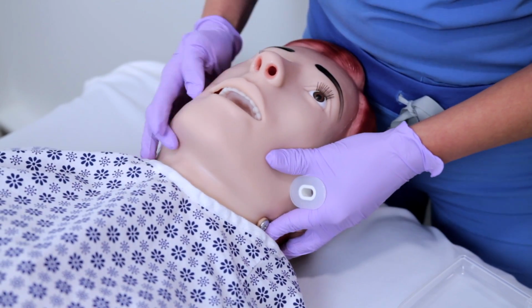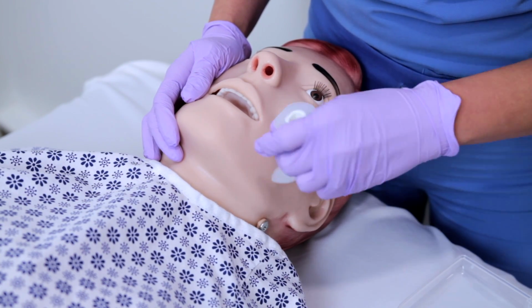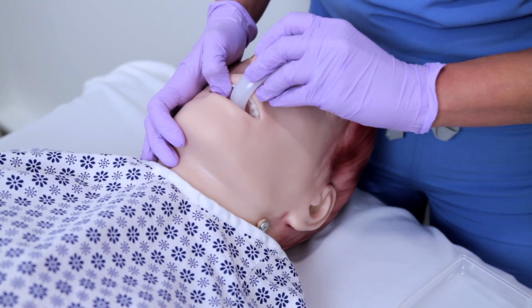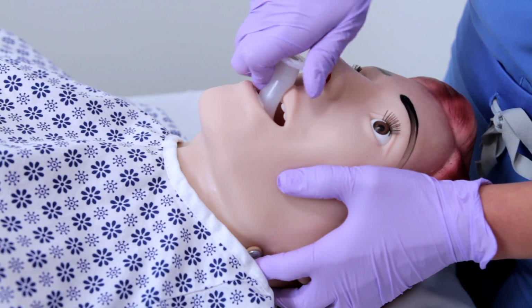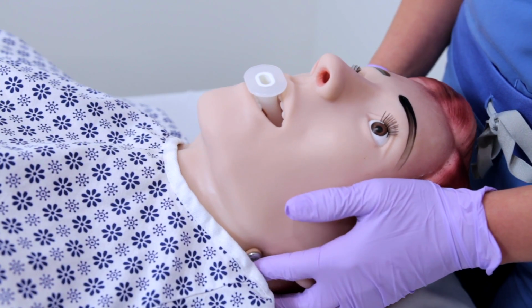So with insertion, tilt the patient's head back for your patient that is not a trauma patient, and no C-spine precautions. The curve goes up and insert the OPA. You will then angle up going past the tongue, then gently rotate the OPA about 180 degrees for an adult patient. Versus a child, insertion is angled down with the OPA as there is no rotation.